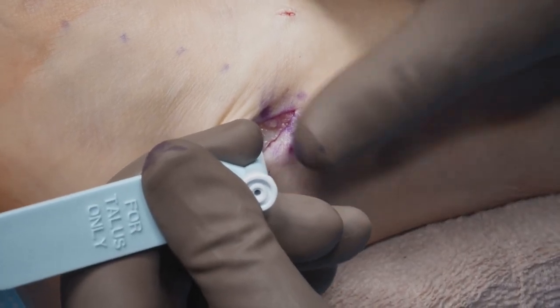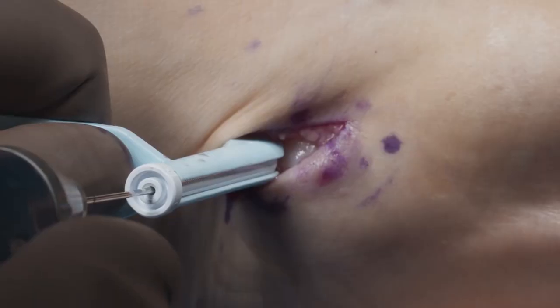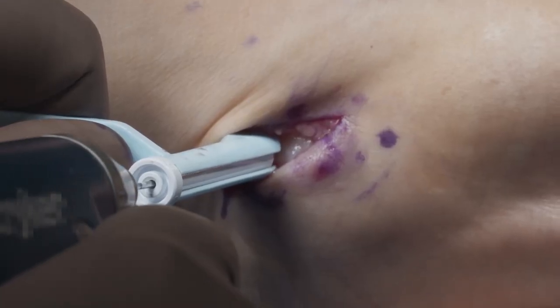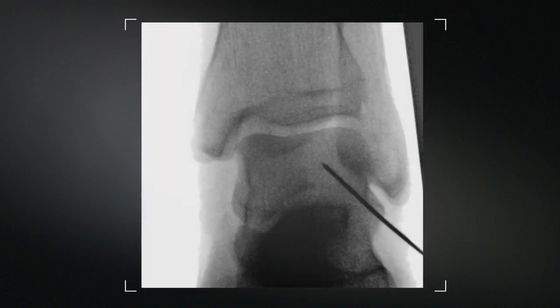Drill the K-wire with the targeting sleeve in the guide into the non-articular area of the talus, and drill back into the body parallel to the bottom of the foot. Confirm with fluoroscopy that your K-wire is in the correct position both medial-lateral and anterior-posterior.